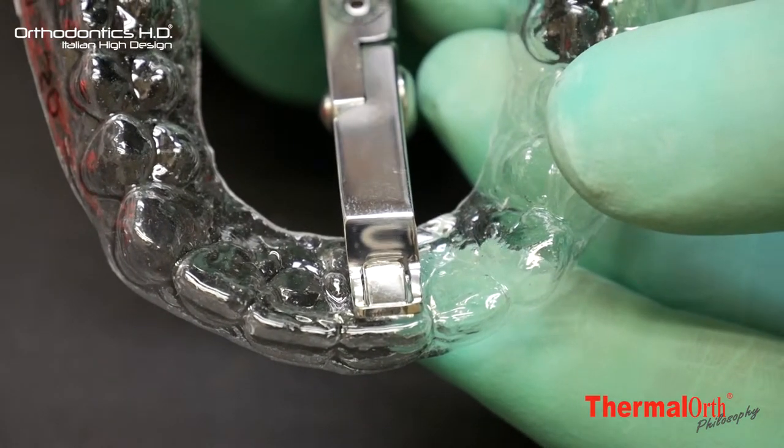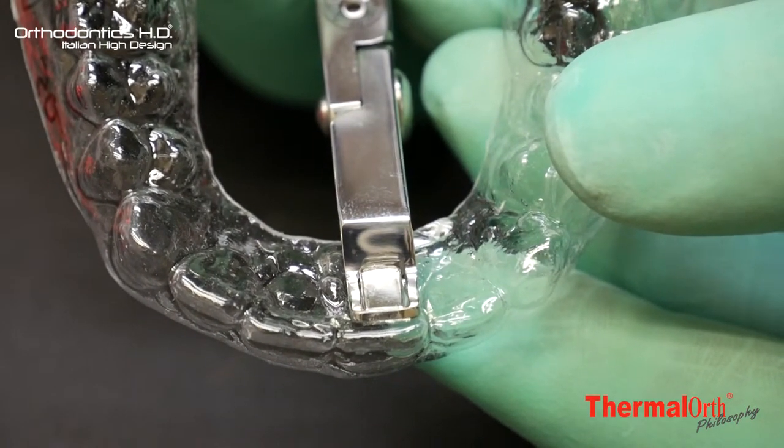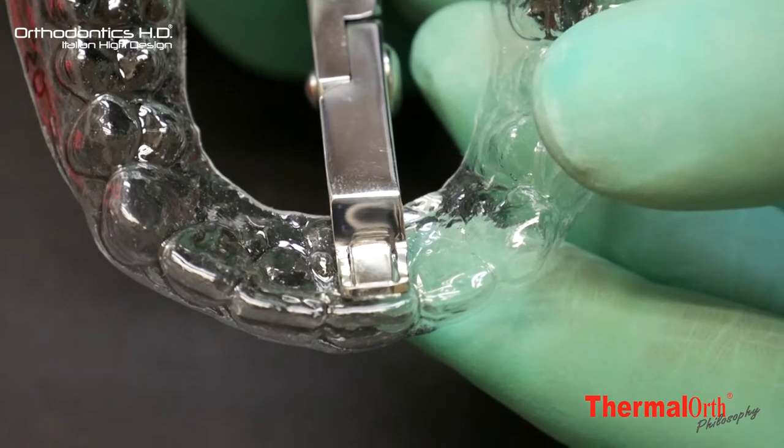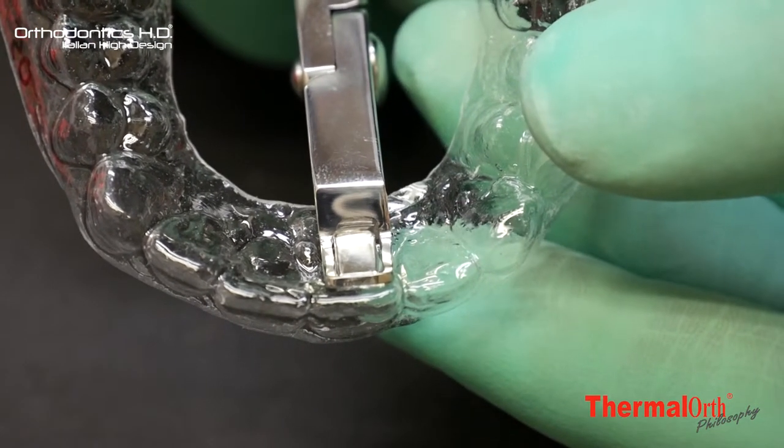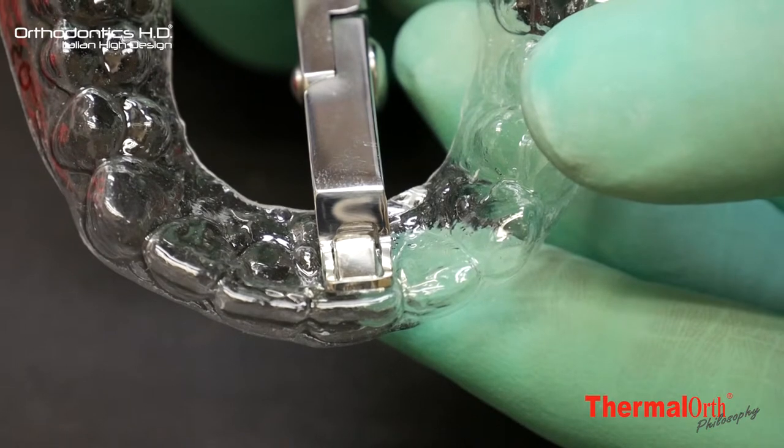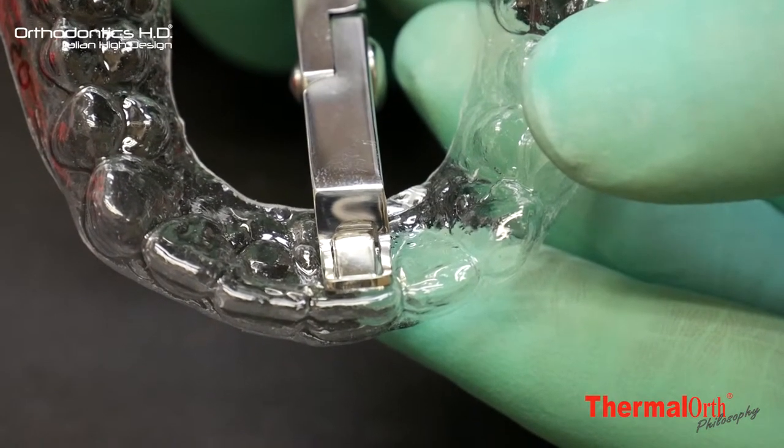The screw, previously adjusted, allows the planned bite plane size. Cool it down by air water for 15 seconds and gently remove the plier from the aligner.